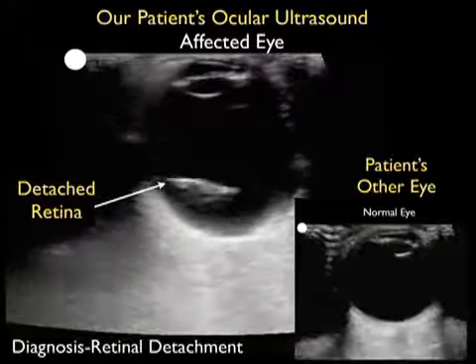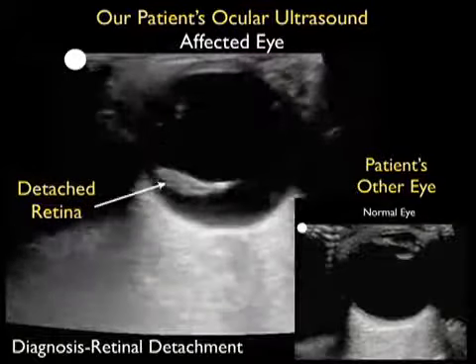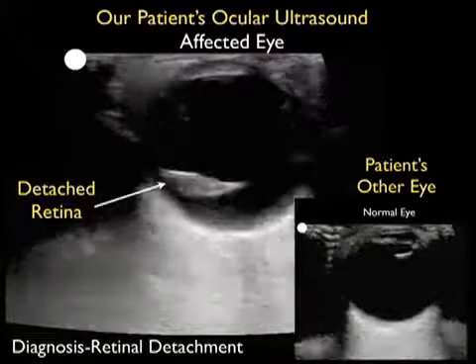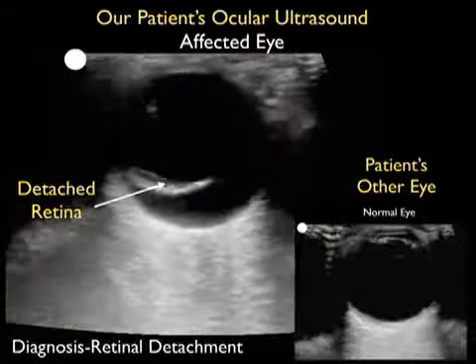So in the affected eye, this is actually a detached retina that's moving around as the patient looks up and down, and we have the probe positioned over the patient's eye. So right away our diagnosis within immediate orientation of the probe onto the eye is retinal detachment.